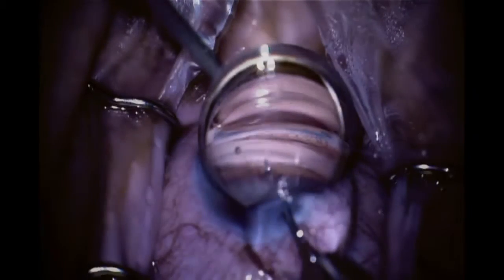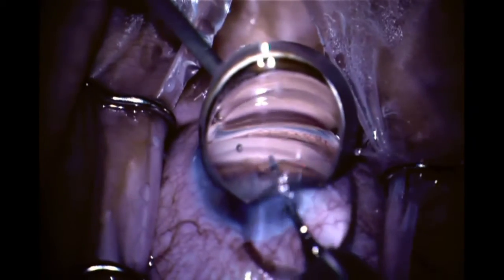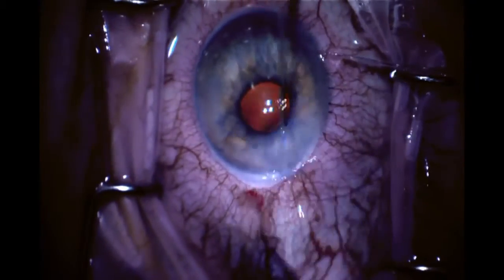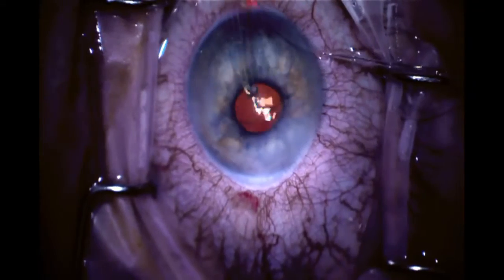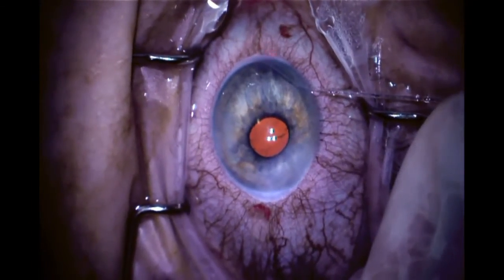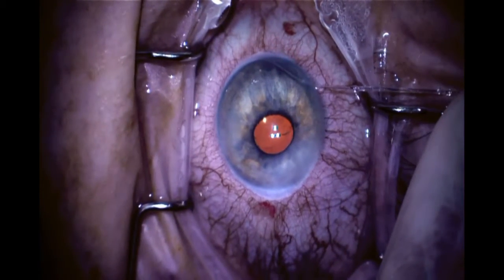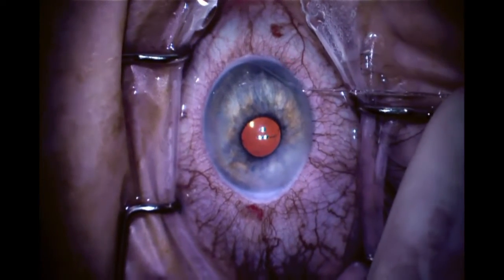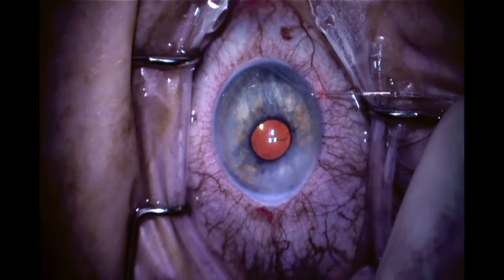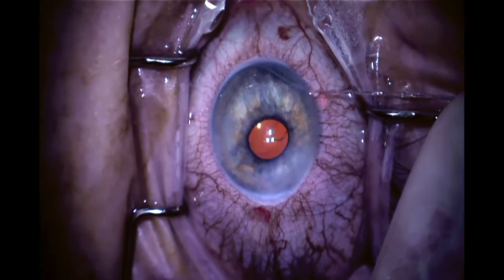Skipping ahead, you can see that this catheter has traveled 360 degrees. We then rotate the eye so that it's facing forward again and irrigate the dispersive viscoelastic from the surface of the eye to get a clearer view. We then slowly begin to retract this illuminated microcatheter, stopping every clock hour or so. I say 'click,' and my assistant injects a small aliquot of viscoelastic. You can see we're making our way around here.